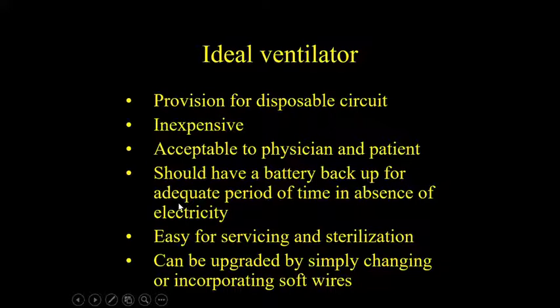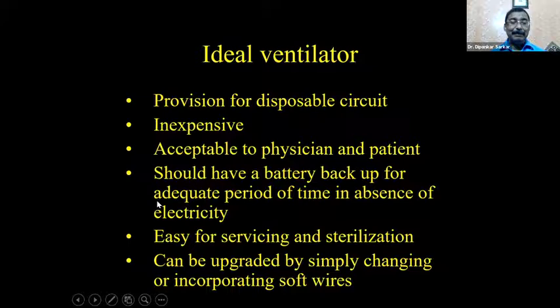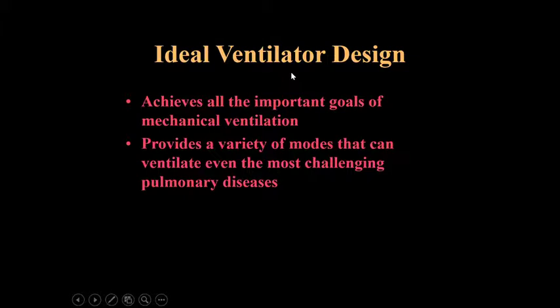Easy for servicing and sterilization, and can be upgraded by simply changing or incorporating software. So a ventilator is there, and even with that same ventilator, you can upgrade it by introducing some software. Okay. So the ideal ventilator design is all these things. Now, basic things about ventilators.